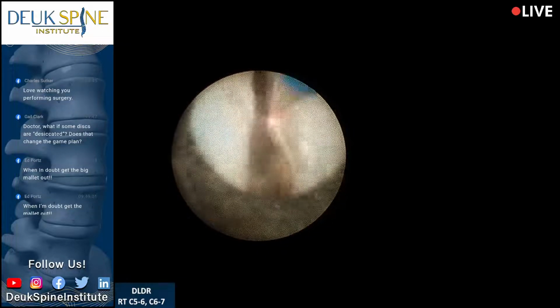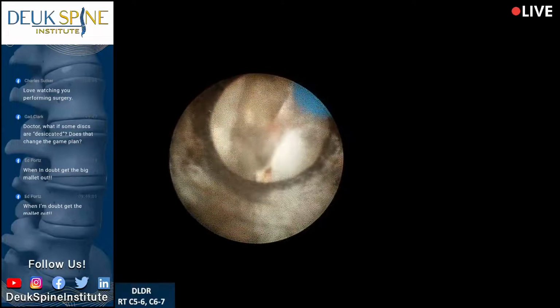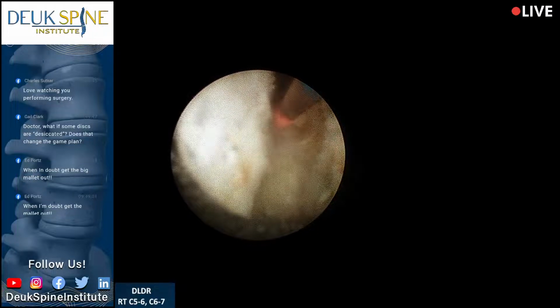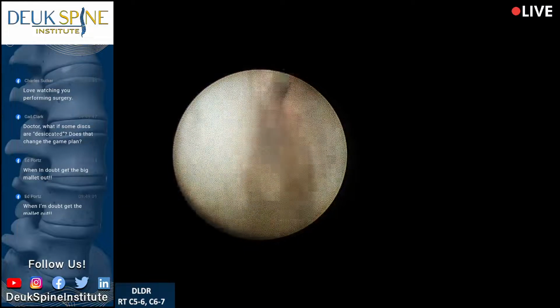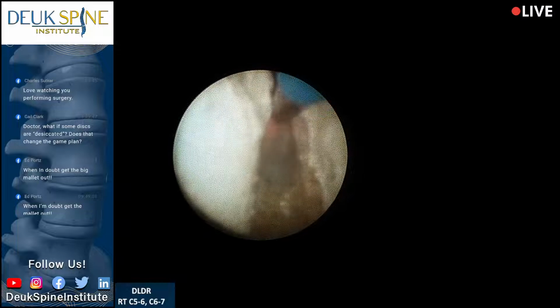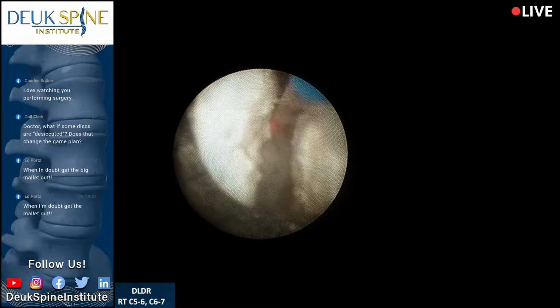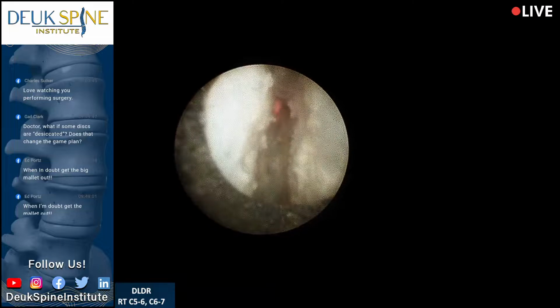All the most minimally invasive surgeries done today in neurosurgery and the spine use lasers. So the problem is that most neurosurgeons don't know how to use lasers, and they don't know how to do endoscopic surgery. So they end up telling their patients not to get it done because, of course, they don't want to put themselves out of business. But the reality is that laser is the best way to fix herniated discs and a lot of brain tumors.